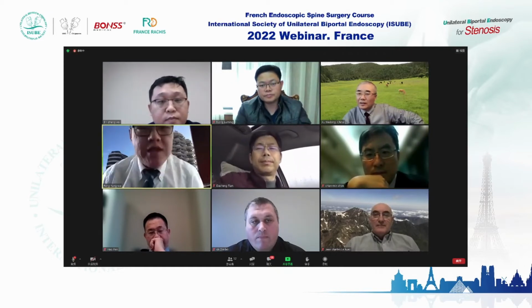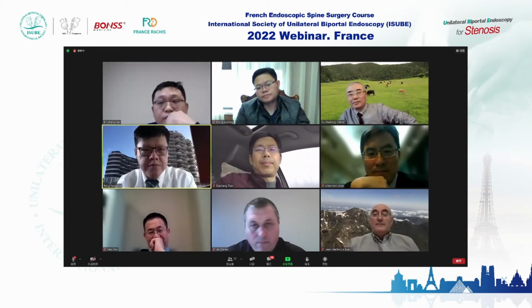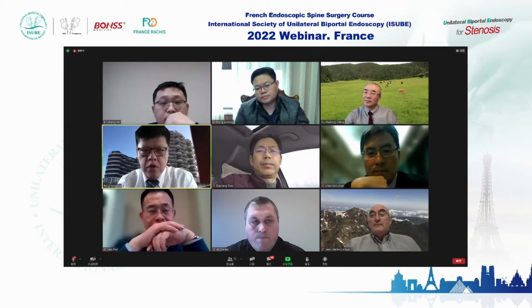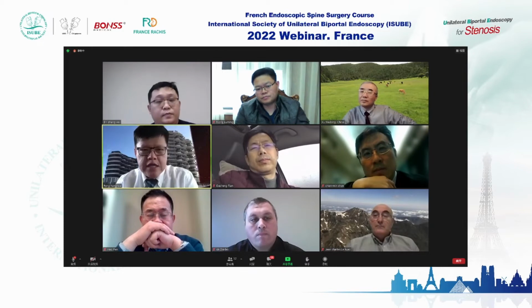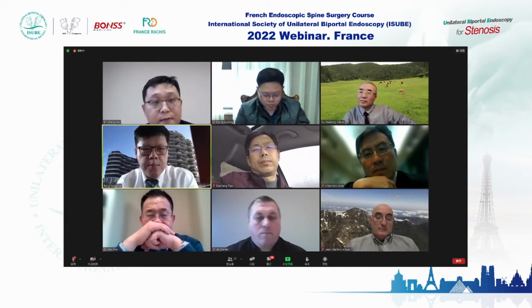I'm an orthopedic surgeon. I did some tubular PCF, posterior cervical foraminotomy. Then I moved to uniportal and then biportal. I still do both uniportal and biportal. I stopped using tubular. For foraminotomy, if I just have a disc to remove, I would tend to do uniportal. But if they need a wide laminotomy, and I feel that I need to remove more bone, I prefer to do biportal. I think in the literature, biportal has 2 ways to approach the foramen.